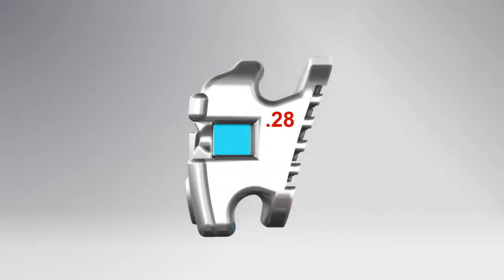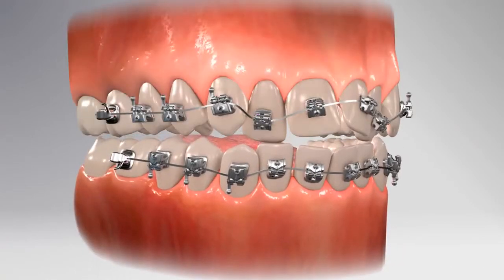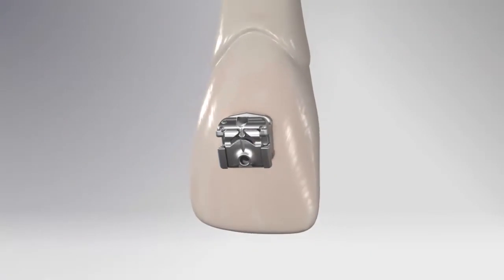The Carrier SLX bracket has reduced slot depth as compared to other self-ligating bracket competitors. Our slot depth reduces archwire play, improving torque and rotational control. You are now in full control of your cases.